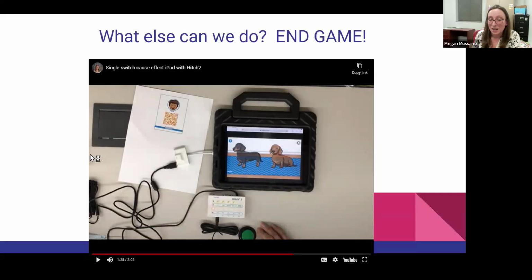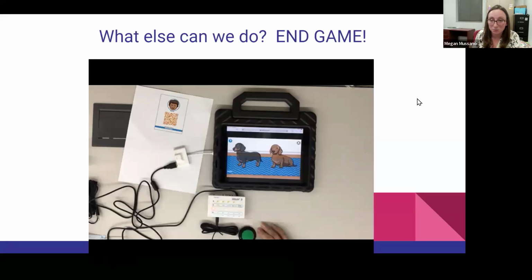And that's it. On the L3 skills, the thing has to quit talking before the prompt comes up to hit your switch. So you can't just go tap, tap, tap, tap, tap. It has to finish talking first. So that's what the rest of the video talks about. But again, it is that easy for our staff or parents to use. With a quick video home, anybody was able to utilize this.